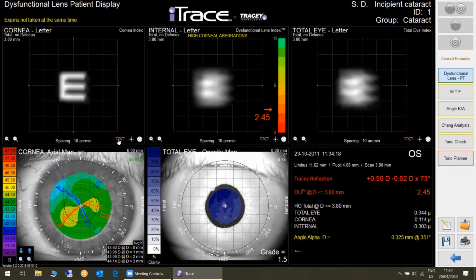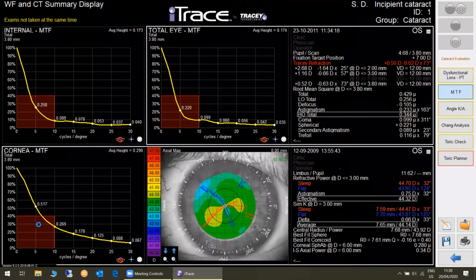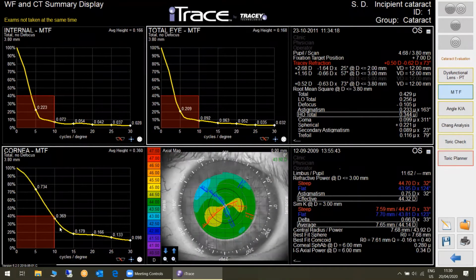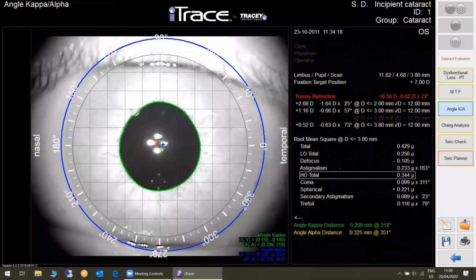Do I have to talk about torics? Yes, it makes sense. Multifocal? No. Well, multifocal toric, yes. How is the orientation? Perfect, thank you. I forgot to tell you, I look very fast because I want to see the 3 crosses inside of the 4 lines. Perfect, please come in.